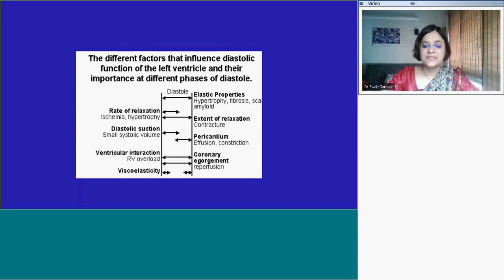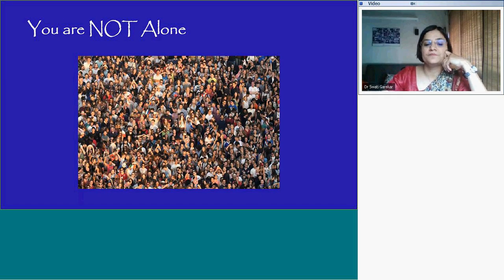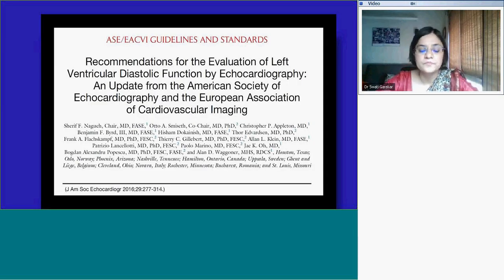Next slide. Covered in the last 40 minutes. Confused? You're not alone. Too much terminology, too much variation, all that and more. Which is why the American Society of Echocardiography and the European Association of Cardiovascular Imaging came together and published this in 2016. And it's freely available, talks about diastolic dysfunction evaluation, and they've really simplified things.